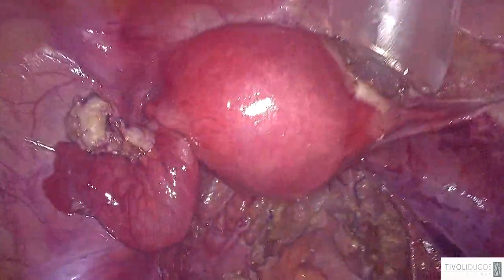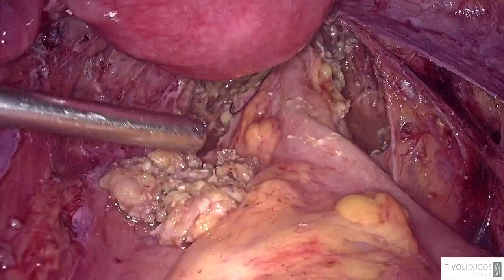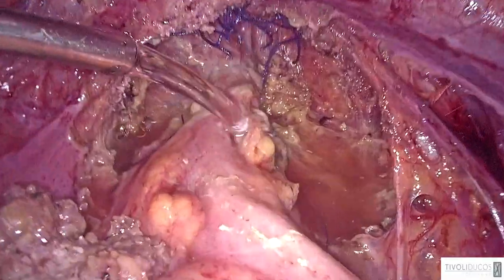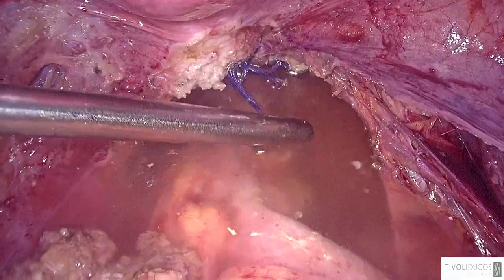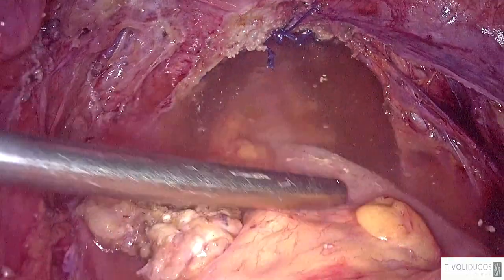Because it is only semicircular, while when you carry out a colorectal resection, you have a risk of stenosis, and I demonstrated it. I demonstrated it in the endo randomized trial. There is a risk of stenosis of about 8 to 10%. No risk with the disc excision.